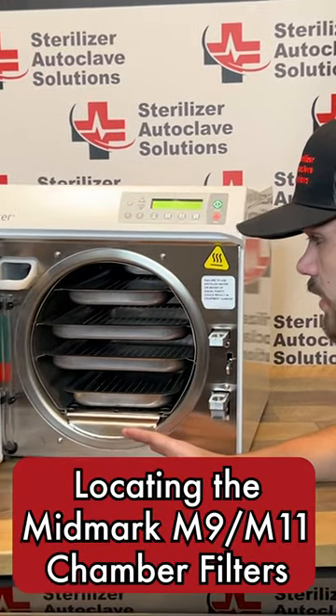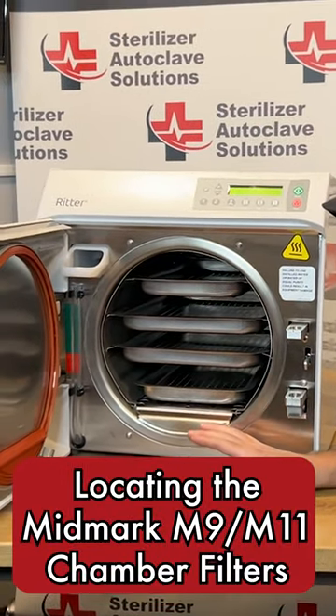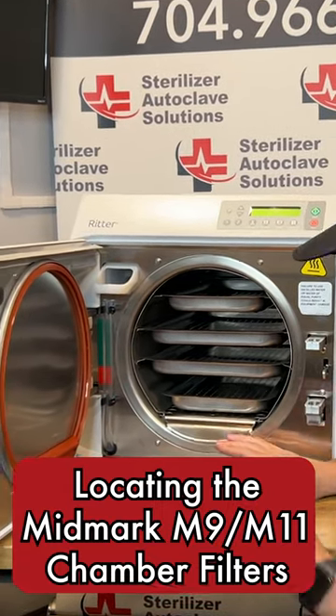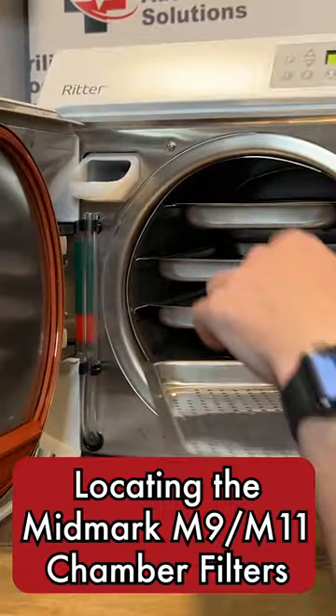Today we're going to be looking at an M11, and we're going to start inside the chamber. For the first part of the PM kit, we're going to be looking at the chamber filters, which you do have to remove all the trays.